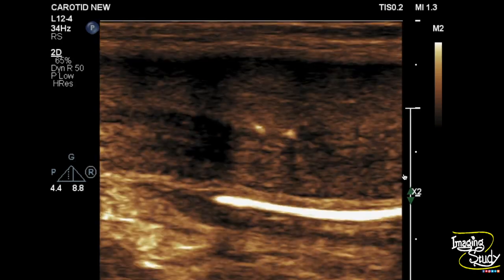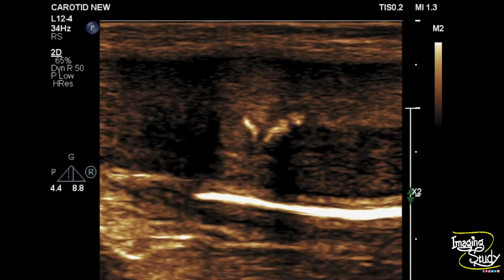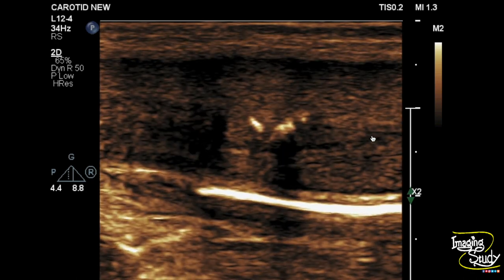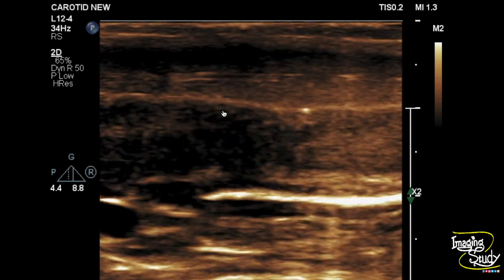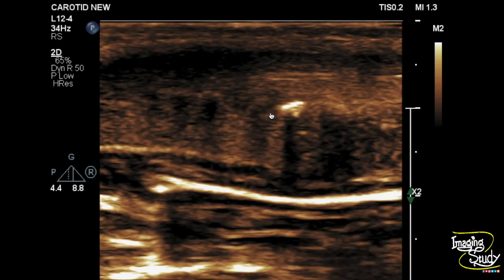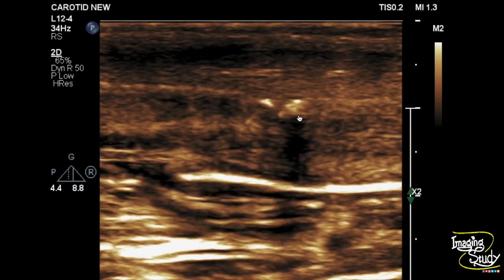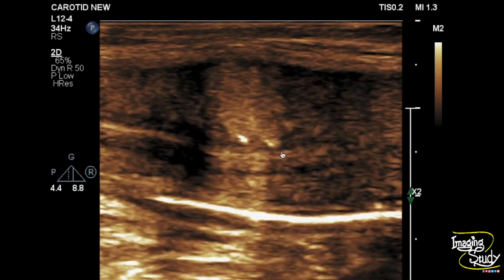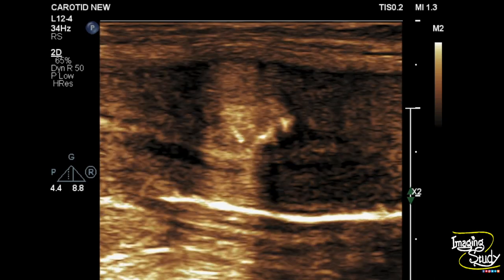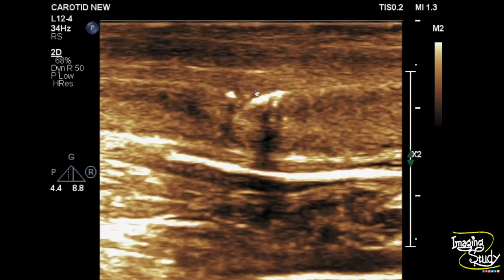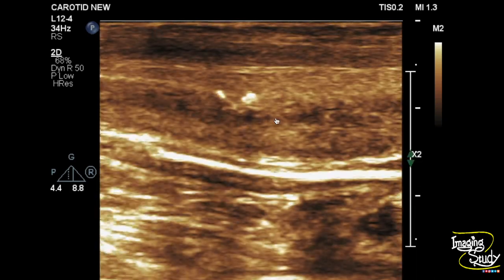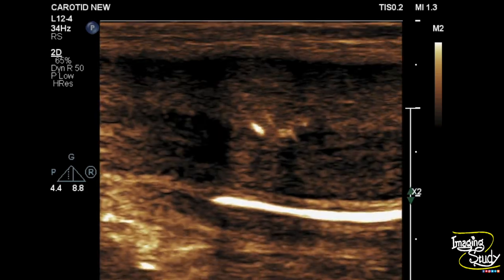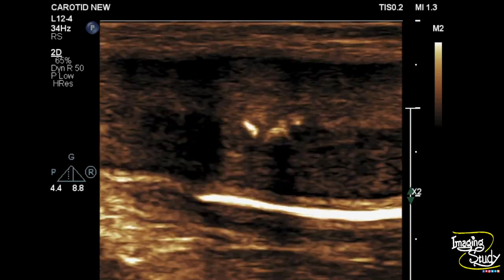This is the longitudinal section between the two corpora cavernosa. You can see the tunica albuginea layer, which shows some calcified plaques — these are fragmented calcific foci within the tunica albuginea. There is no associated vascular wall involvement. These calcified plaques cause painful erection as well as unusual curvature or bending of the penile shaft during erection.